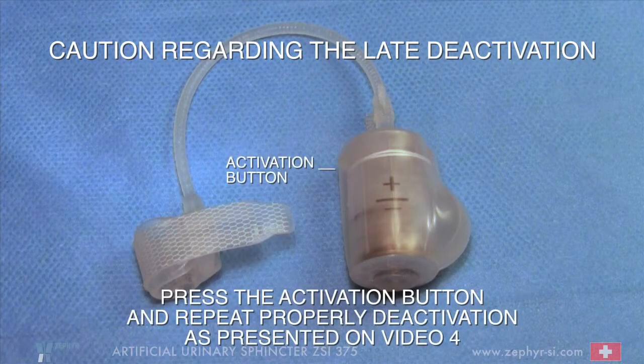Press the activation button and repeat the proper deactivation as presented on video 4.